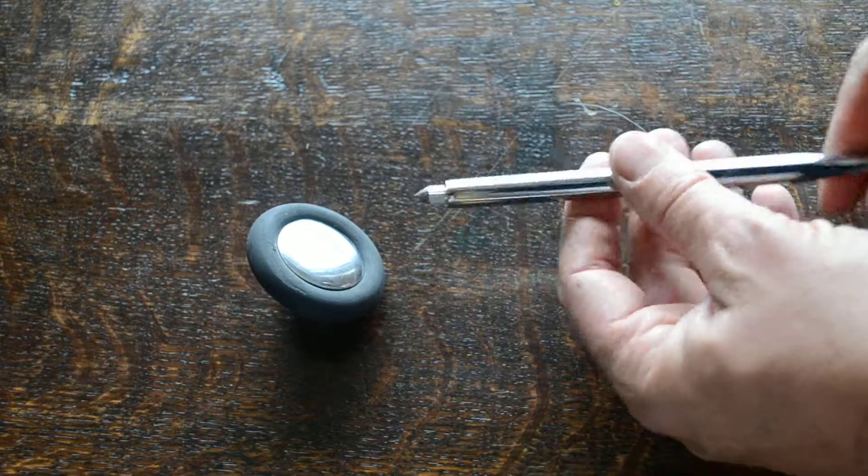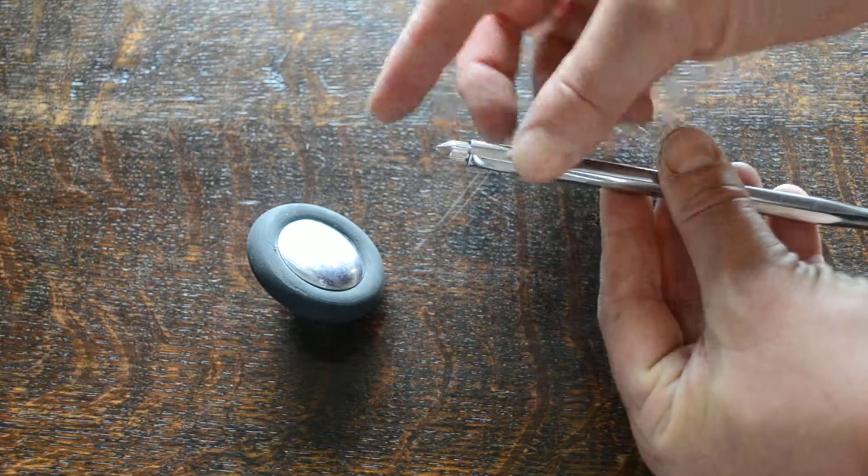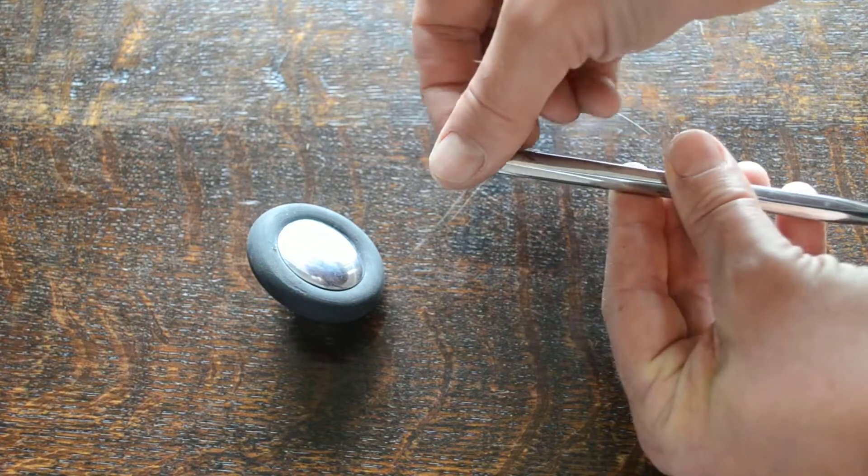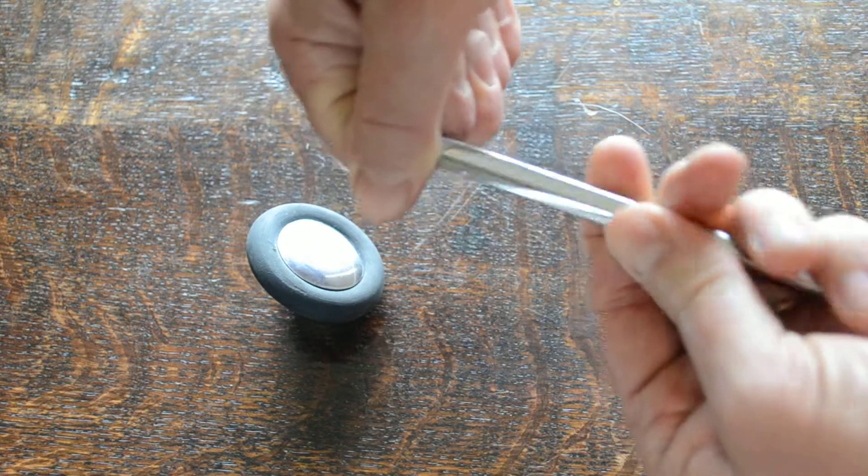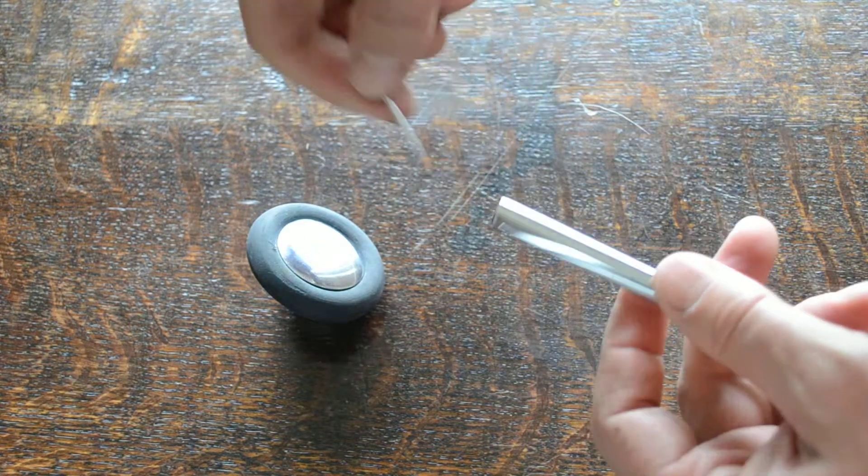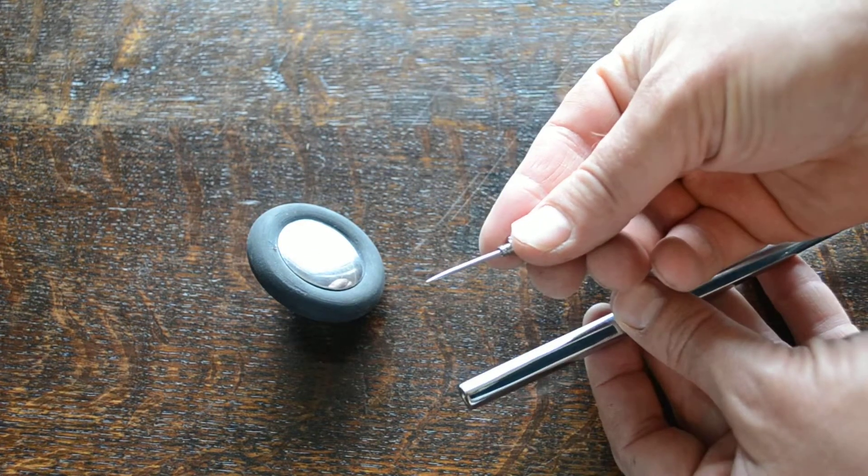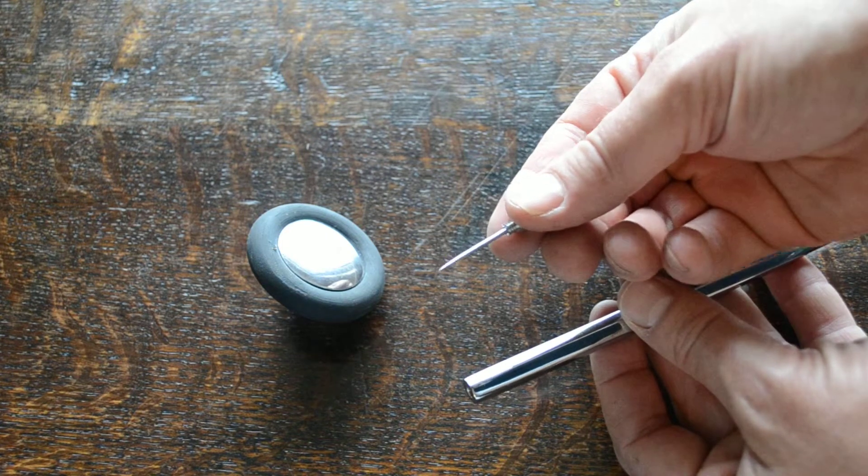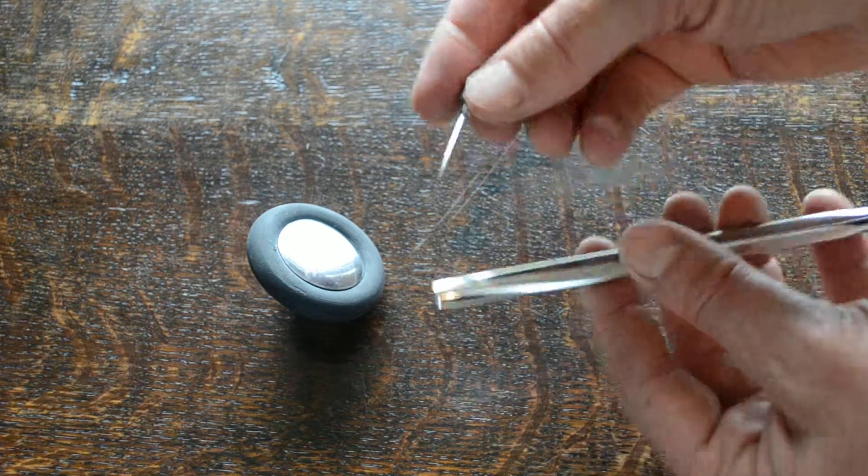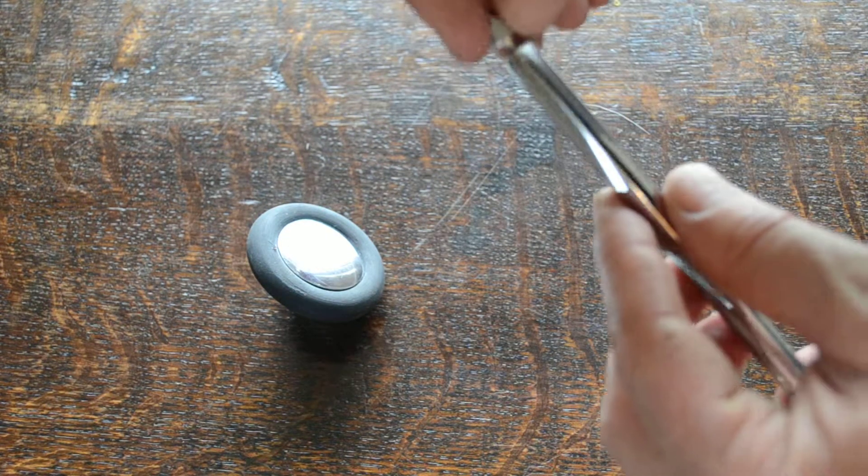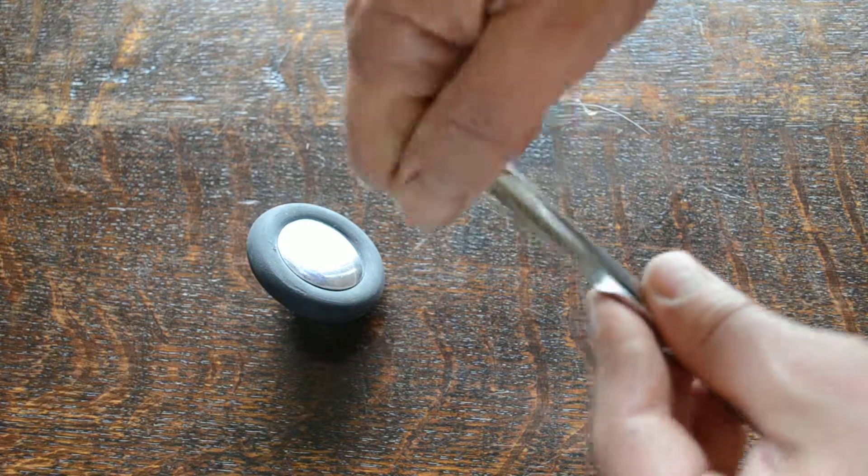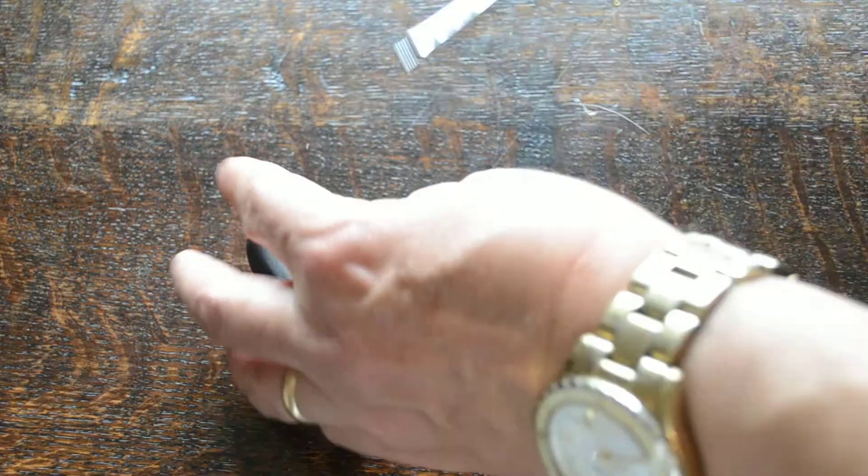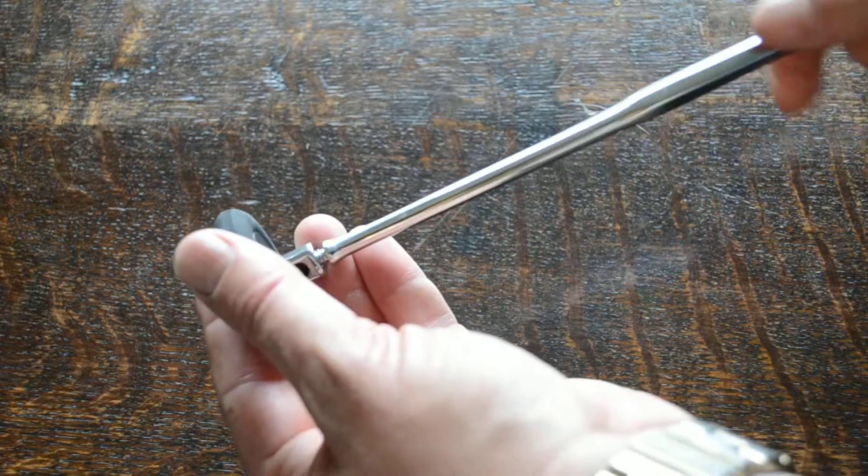The additional feature on this reflex hammer is the blunt point, but this can be unscrewed and in here safely stored in the handle you've got a sharp tip for neurological examination for doing sharp and blunt sensations. That just goes back into the handle and stores very nicely.